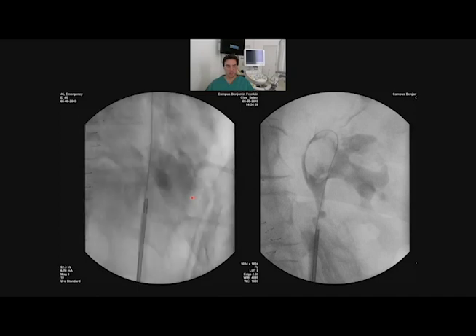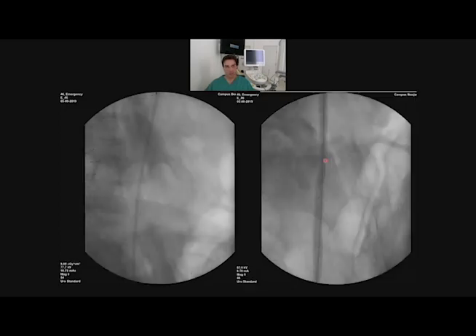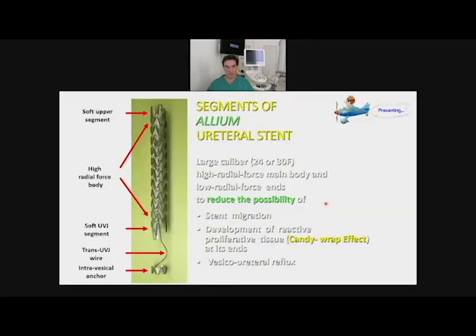This is the picture, what you see here. There was also the leakage. Interesting for us was also that there's something inside of the kidney, and we quickly bring that stent inside. The stent is fully covered, and if you bring a fully covered stent inside, the fluid stays only inside, and so you have a really good drainage. In case of some problems, like a hematoma or a tumor also in the kidney pelvis, then it is also good to put a double J stent also inside. We call it the stent-in-stent technique.